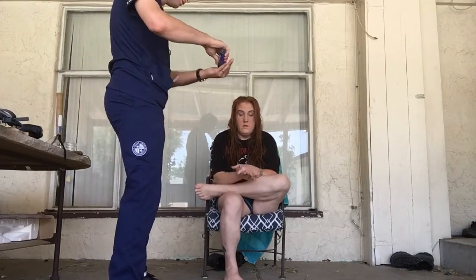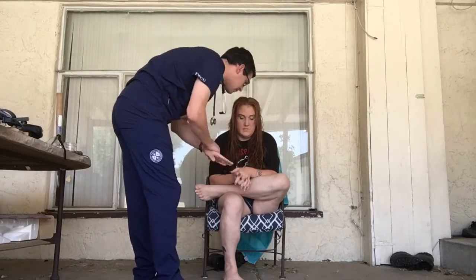Hello, I'm Nick, and I'm going to be your nurse. Can you state your name and date of birth? Allison Bento, 1689. I confirmed on the wristband. Do you have any allergies to food or medication or anything in the environment like pollen or bees, anything like that? Nope. Okay. So we're going to start by taking your vital signs.